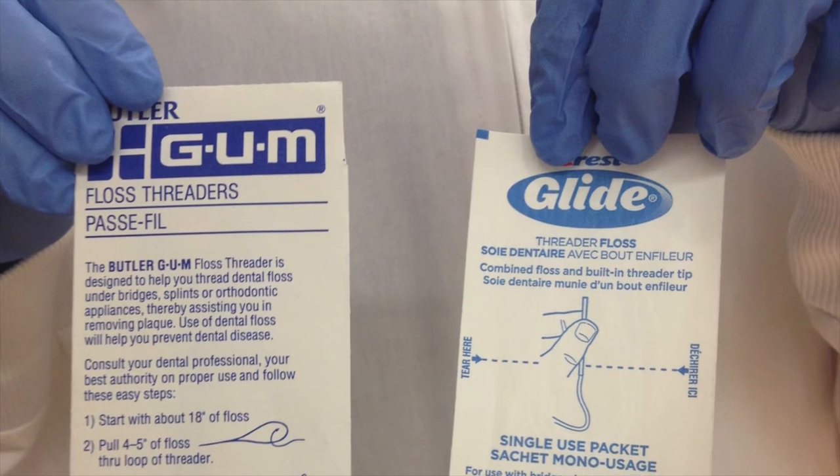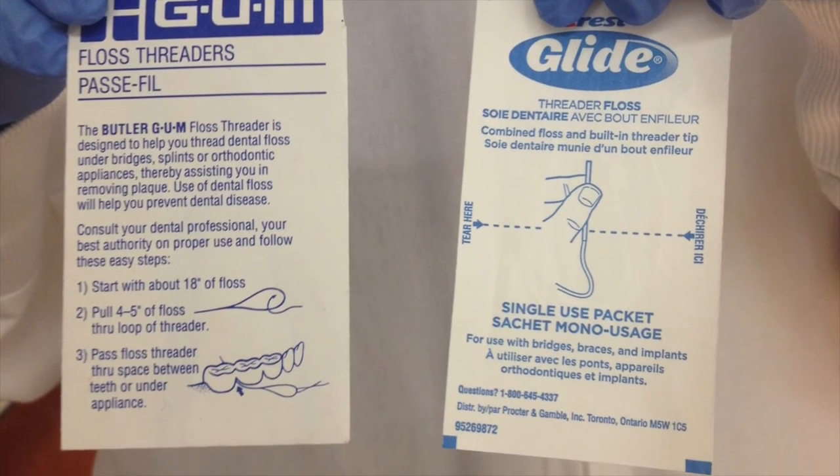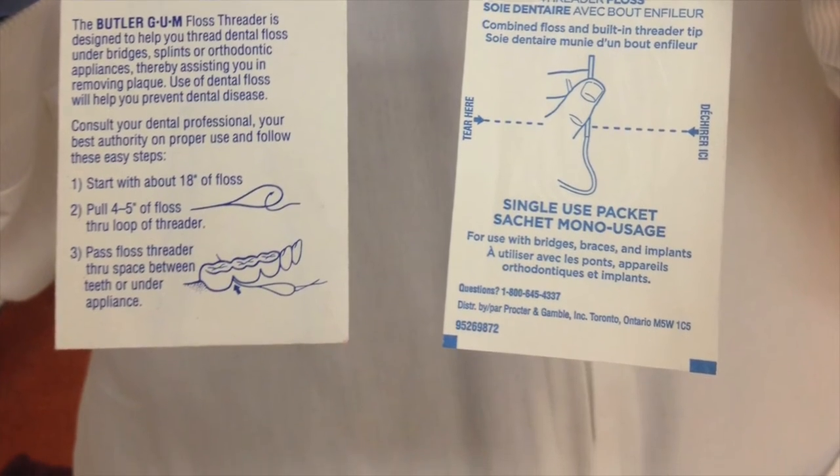Floss threaders. Similar to super floss except that it resembles a plastic sewing needle, and whatever type of floss you prefer is threaded through.